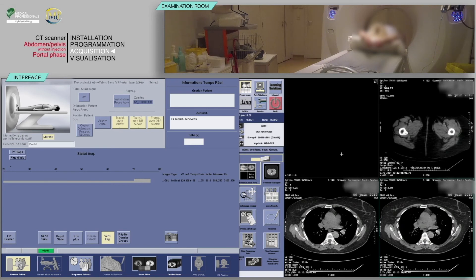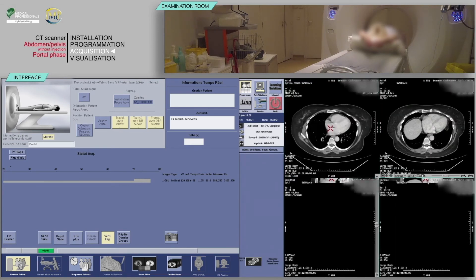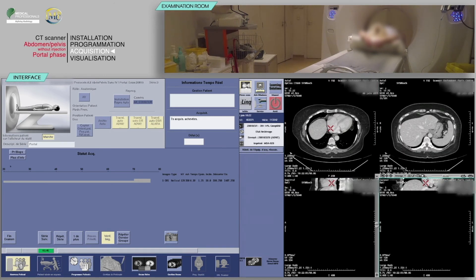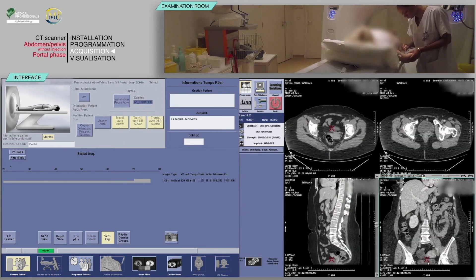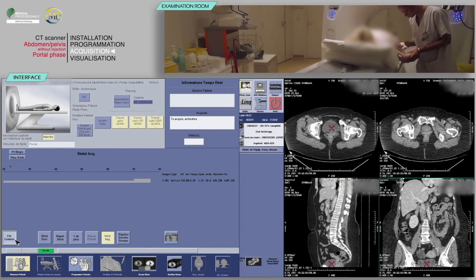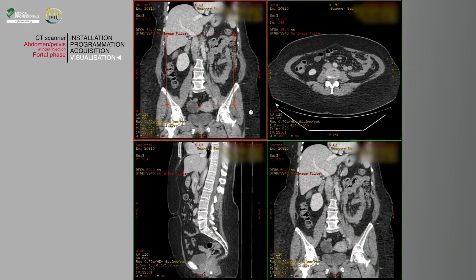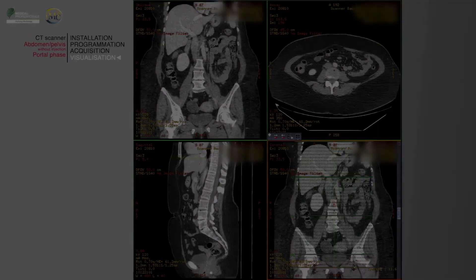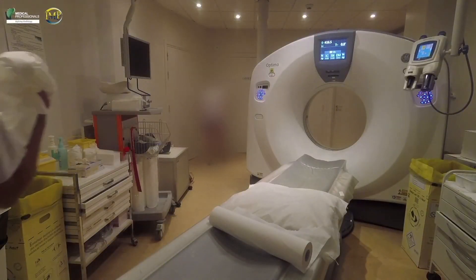Verify the absence of patient motion on the acquisition, and ensure that all anatomical structures are covered and that the appropriate enhancement has occurred. After clicking End Examination, you can do multi-planar reconstructions according to the planes required by the radiologist. At the end of the examination, accompany the patient back to the changing room and tell them they may get dressed.